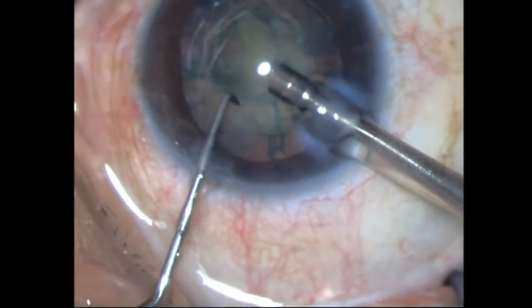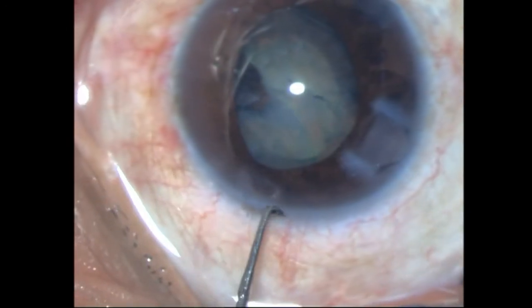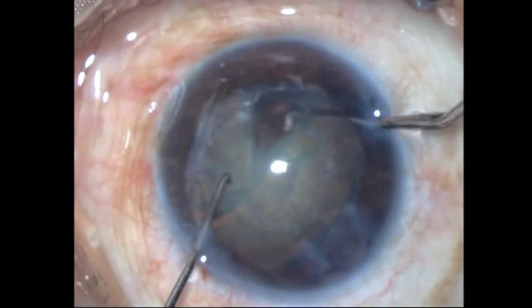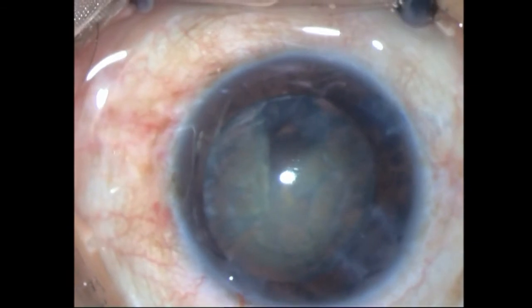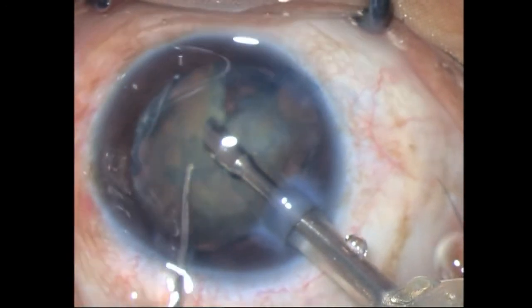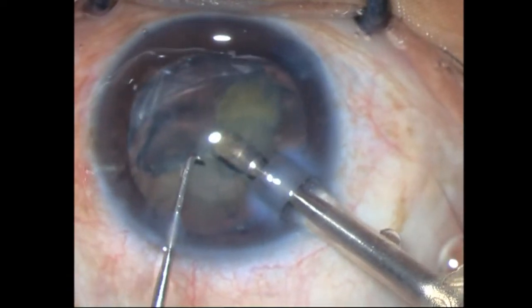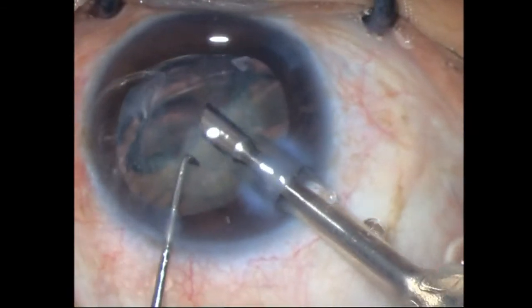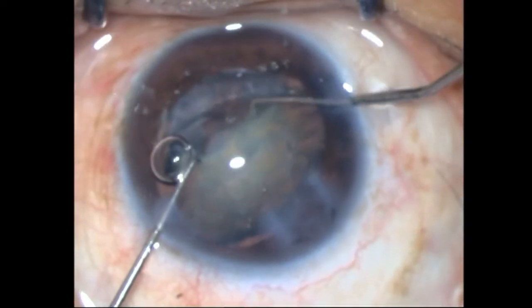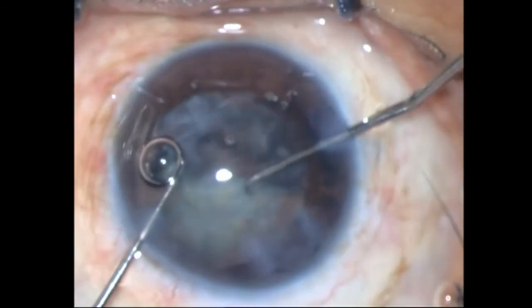Things seem to be going my way. I've put in some OVD and very, very carefully I'm rotating this nucleus — very slowly, taking care not to put too much torque onto the zonules. I'm targeting the hemi-nucleus — I've got out that piece — and then bit by bit I rotate and target the other hemi-nucleus. The iris is also tending to misbehave so I have to be careful. I'm not trying to rotate against the force — I'm trying to pull it as well and then rotate.